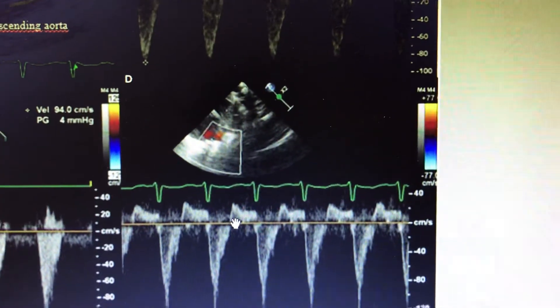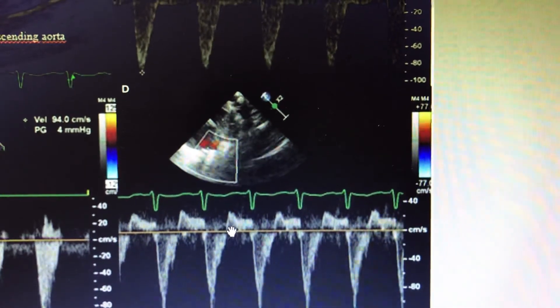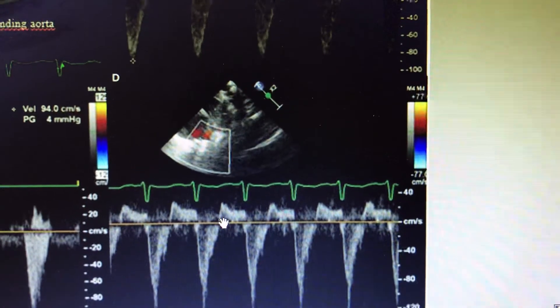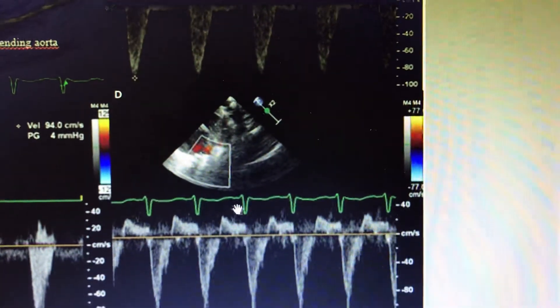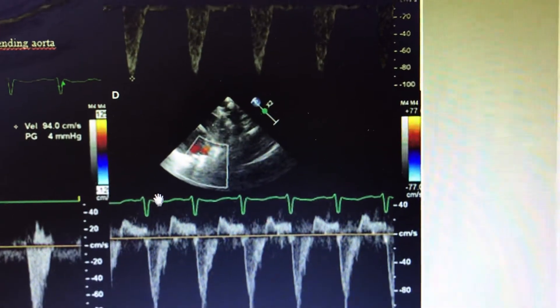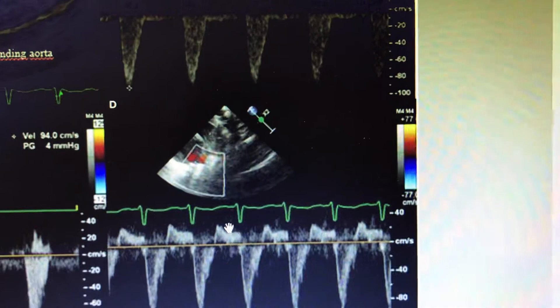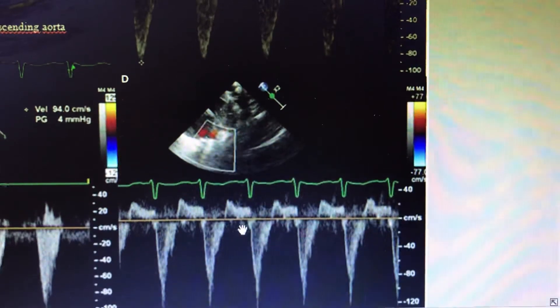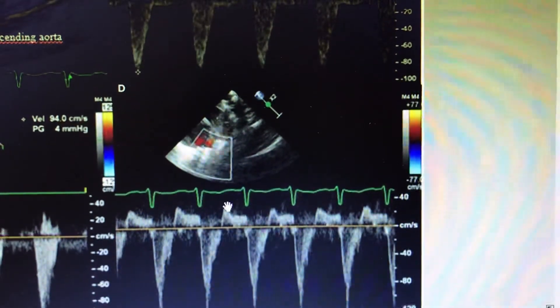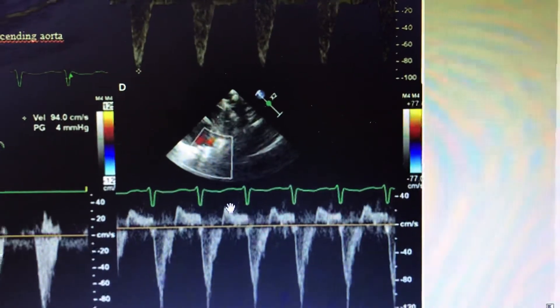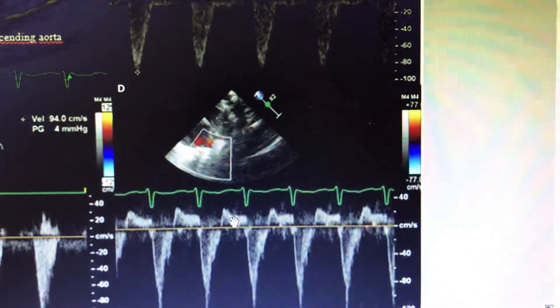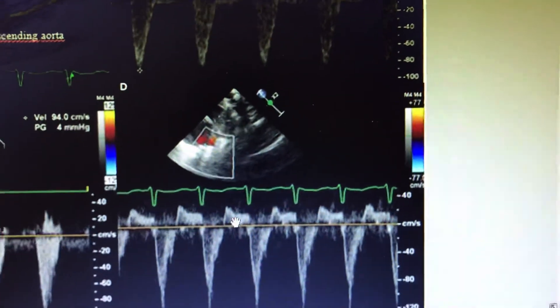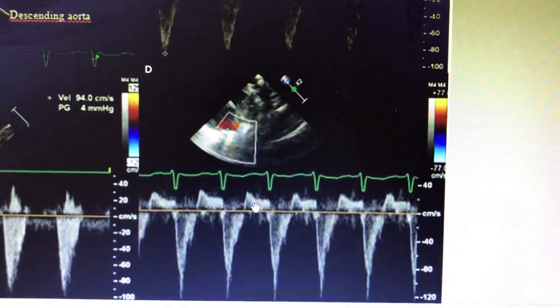This only means that there is a shunt of blood into the pulmonary circulation through the patent ductus arteriosus, and the shunt is so large that some of the blood from the descending aorta is getting shunted back into the pulmonary circulation. It also means that the pulmonary circulation has not yet reached systemic pressure — pulmonary hypertension is not yet present — so there is a huge reversal of flow into the pulmonary circulation in diastole. In one sense, this confirms a non-restrictive large PDA, and it also means the patient is a candidate for surgery, occlusion, or closure of the PDA.